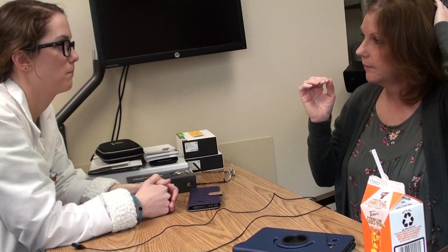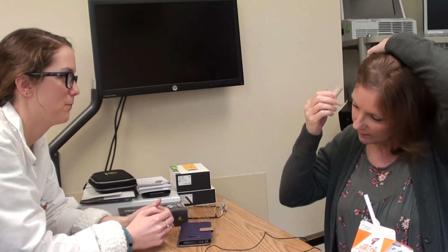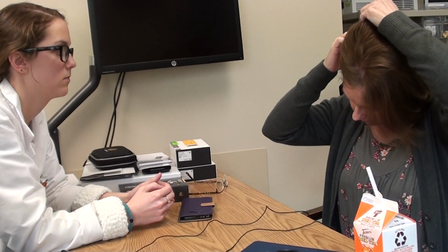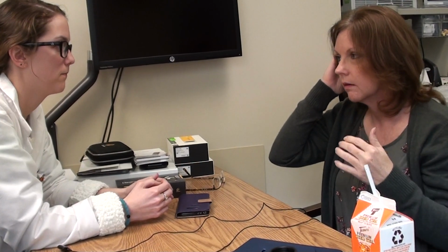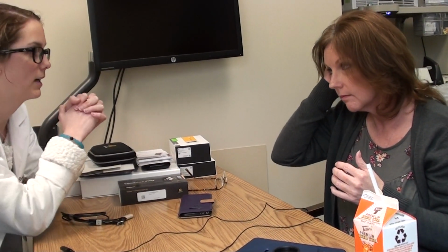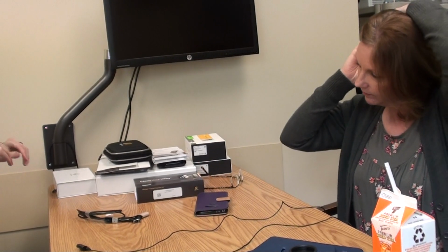Perfect. Okay. Are you hearing now? Yeah. Does it sound loud? Good. Yeah, you'll have to get used to your hair and making sure that it's not knocking it off. When it hit the first time. There we go. Yes, I think that might be better.